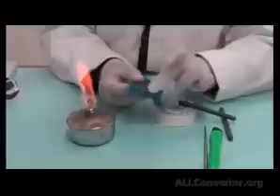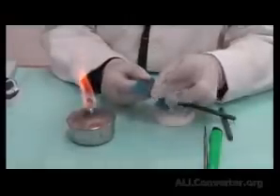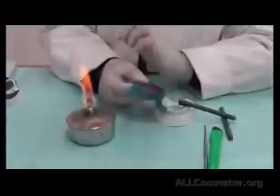While once more I'm border molding or shaping the border just before taking it in the patient's mouth, I smooth the material. No additional creases are there, and not a lot of material is flowing to the outside, so we have the material ready. But while I had been finger manipulating it, it dried out and cooled down. So it's not flexible enough to go into the patient's mouth.